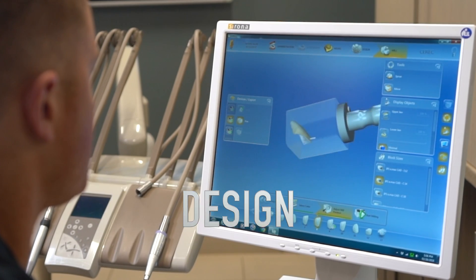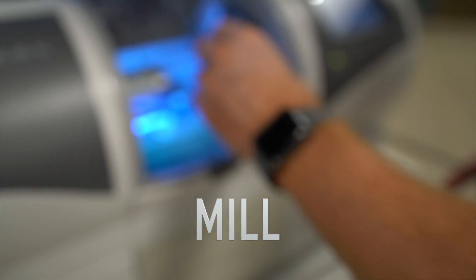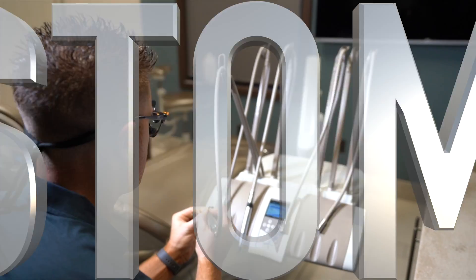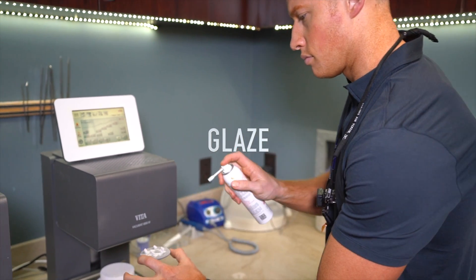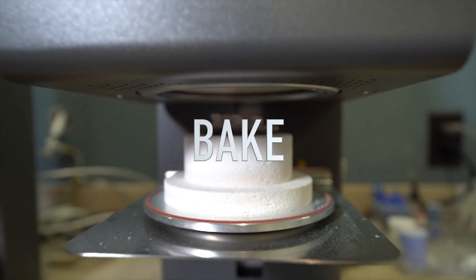We're going to go ahead and design them, mill them, glaze them, put them in the oven and bake them. All right, the veneers are ready.